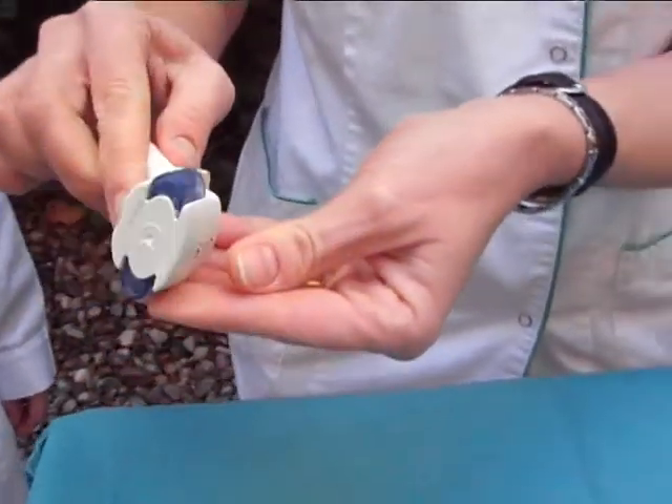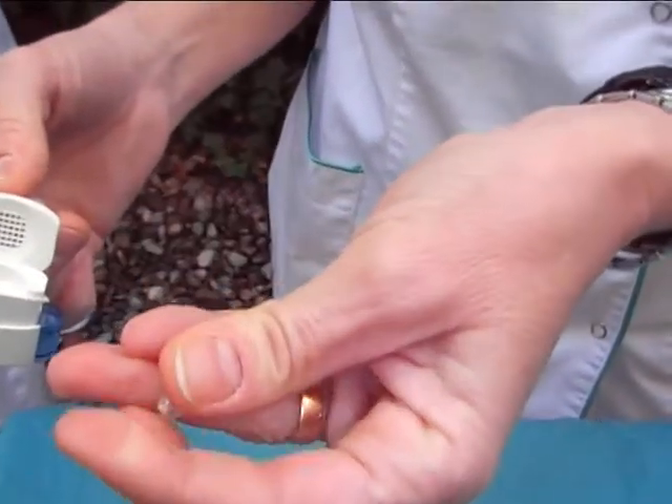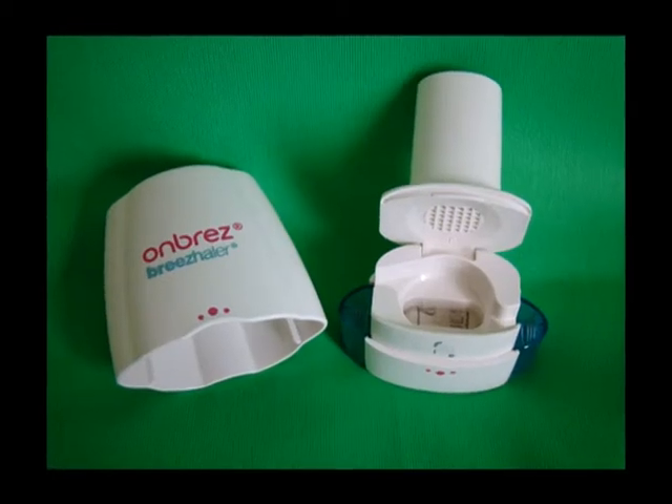To make sure that the capsule is empty, lift up the mouthpiece again. Finally, put the cap back and rinse out your mouth with water, at least one blow with water.